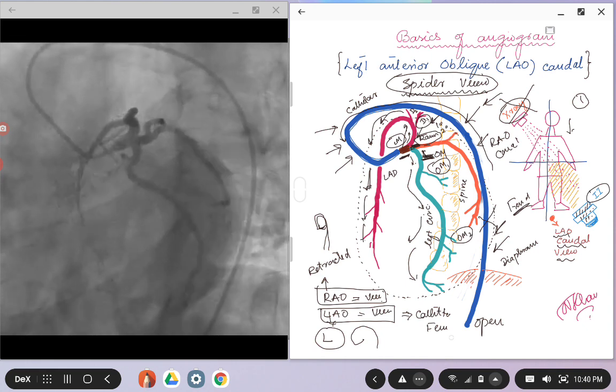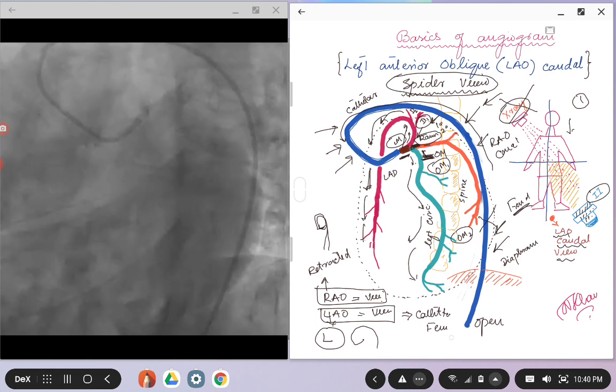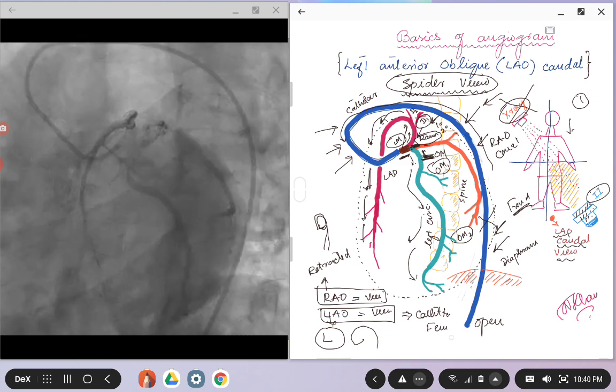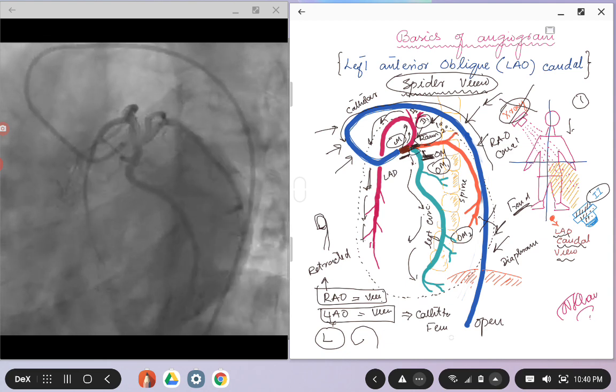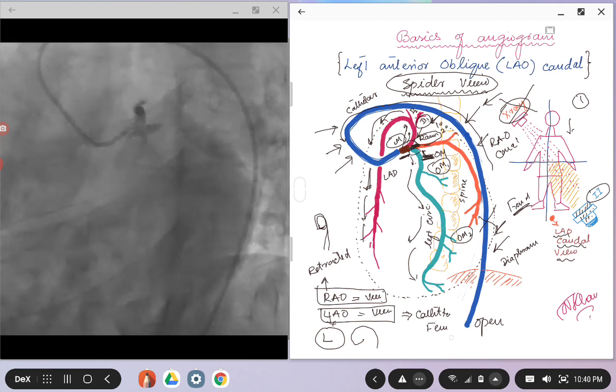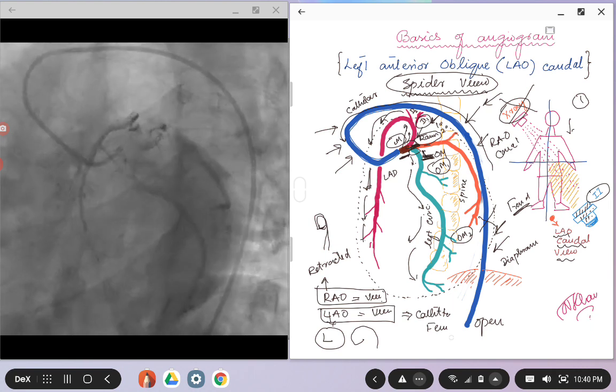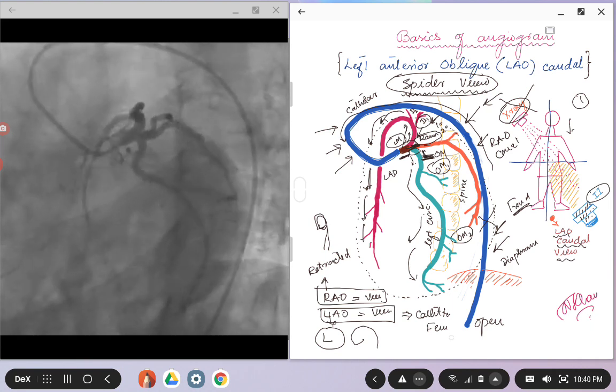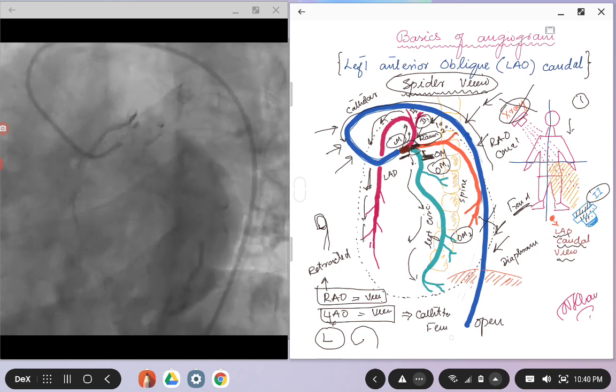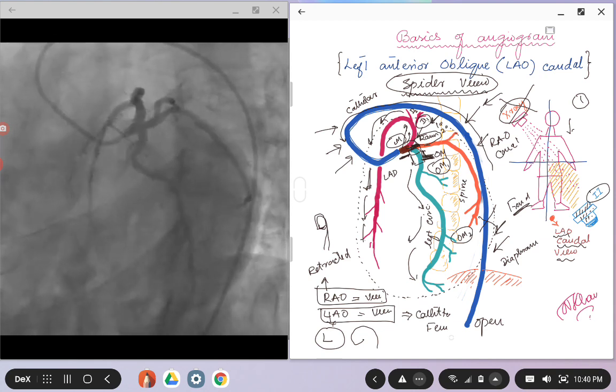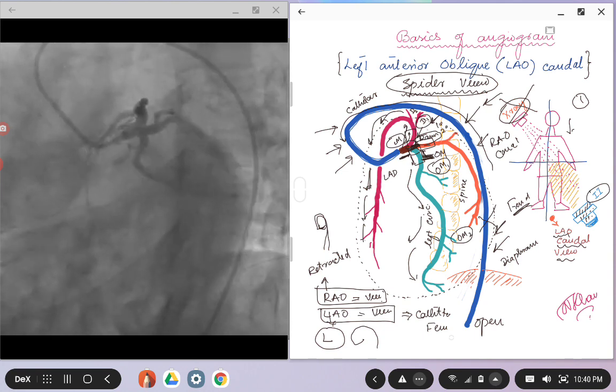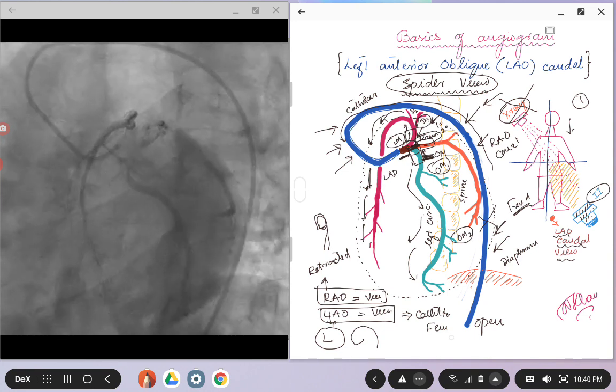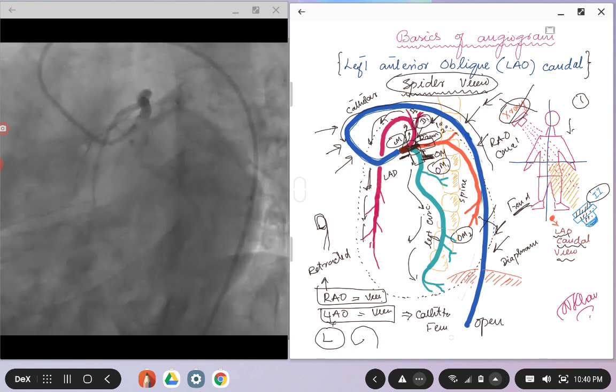So now we recognized the arteries, where their anatomical location is, and how do you see their ostium, which is very clear in this picture. So as we talked about, this LAO caudal view is very good for the bifurcation and the left main and the proximal portion of either the left circumflex, ramus intermedius, LAD, or even seeing the proximal portion of the diagonal branches.